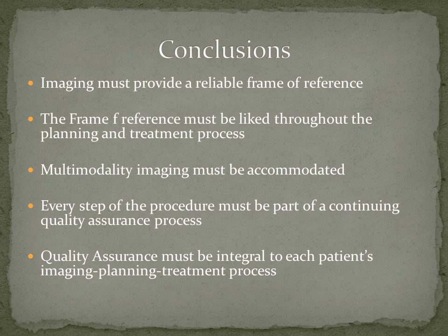Every step of the procedure has to be part of a continuing quality assurance process. And a quality assurance process must be integral in every patient's imaging treatment process. So today, every patient will be part of this process. Everybody you see in the OR is part of this process when you do any stereotactic work.